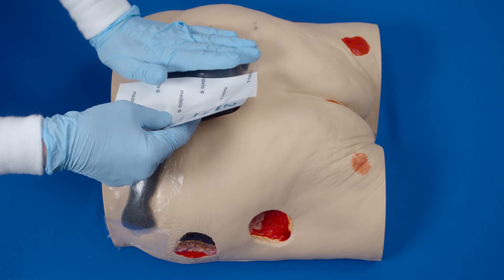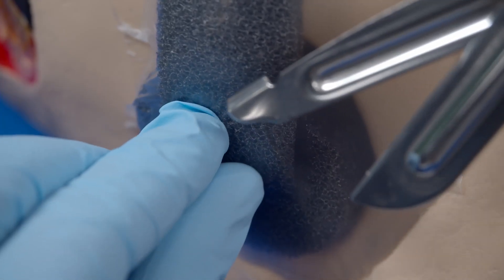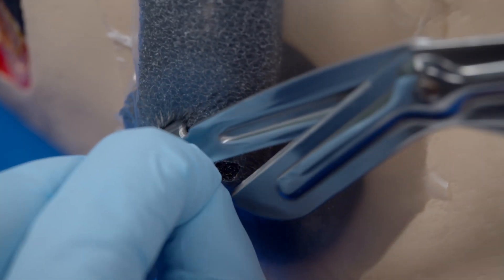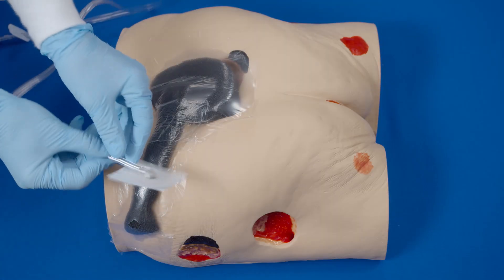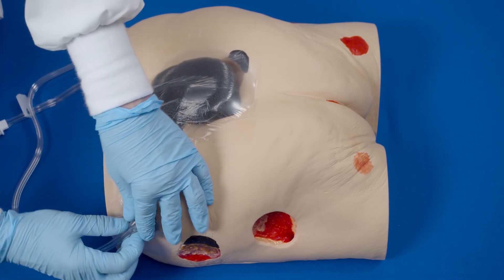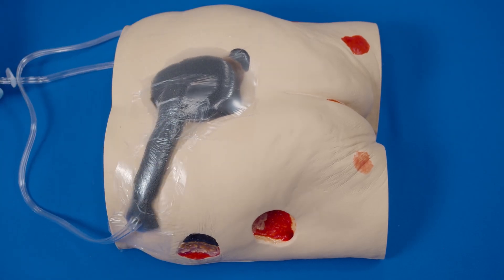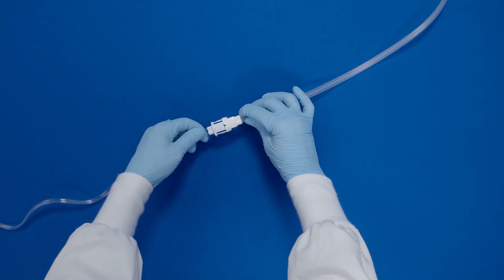Select a central area to place the fit pad on the relocation site. Pinch the film, lifting slightly, and cut a small hole approximately one centimeter in diameter. Peel off the backing of the fit pad to expose the adhesive. Place the fit pad centered over the previously cut hole and press firmly for adherence. Attach the dressing tubing to the pump tubing by pushing the quick connector together until you hear a secure click.